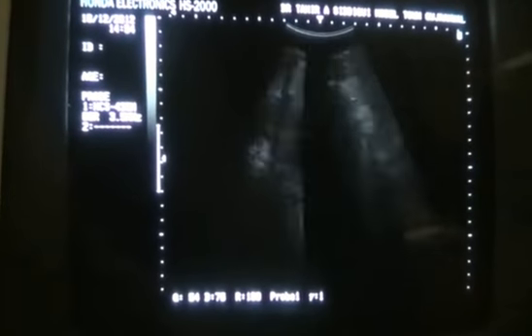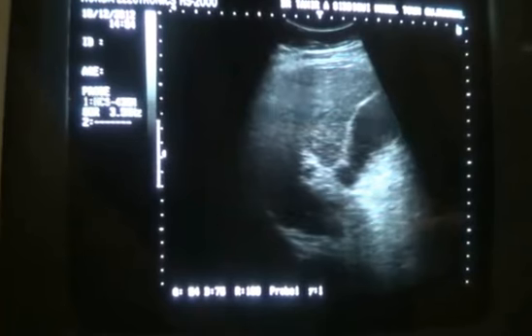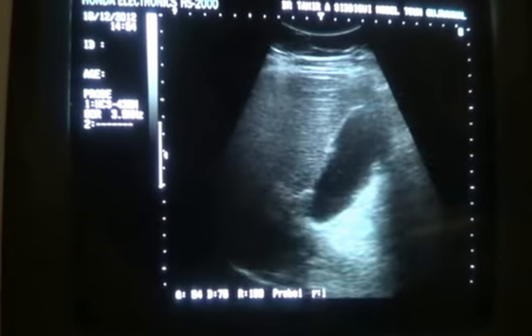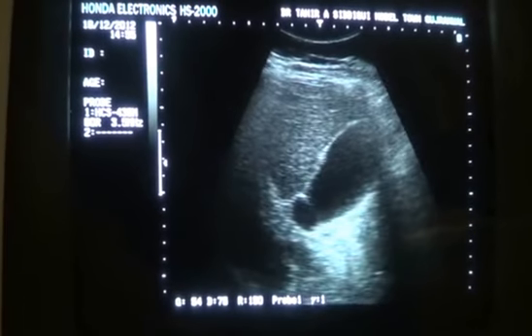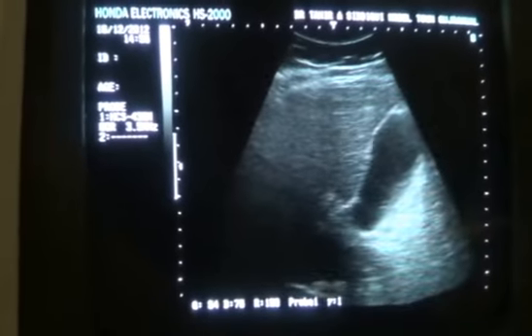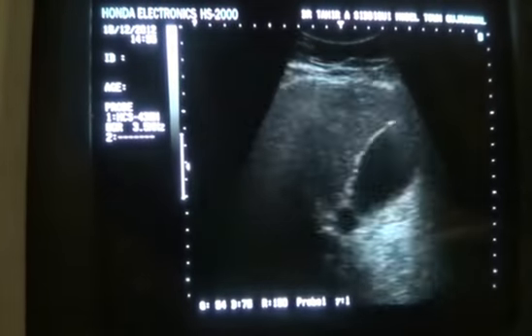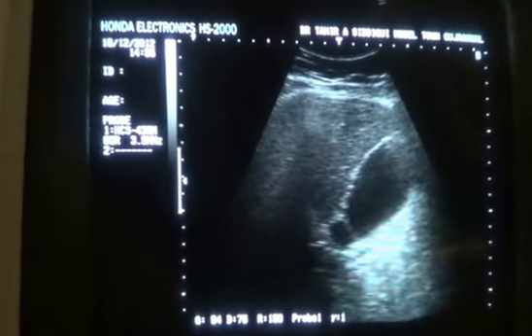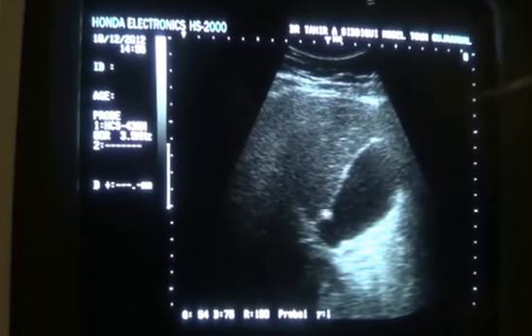Now, see the gallbladder wall. The gallbladder wall will show a very characteristic appearance. So this is one form of the gallbladder wall. You will see the shagginess of the wall.